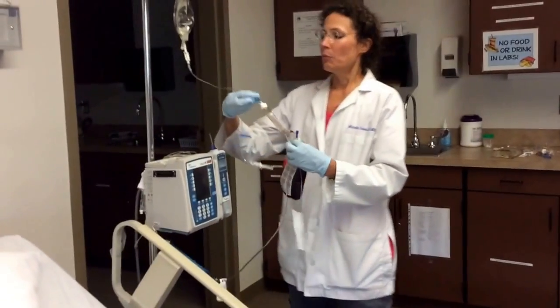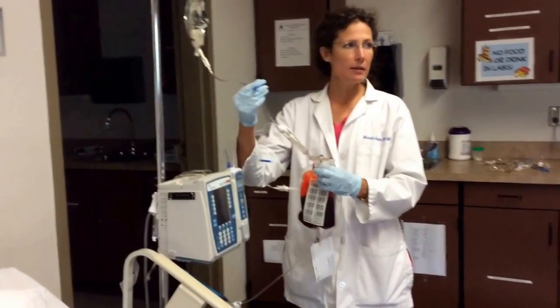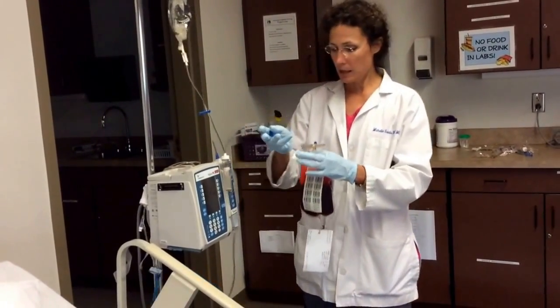All right, before I spike my blood, I'm mindful that the clamp on my saline is closed, okay?